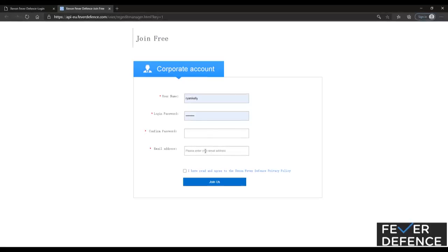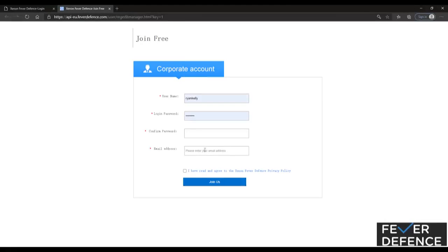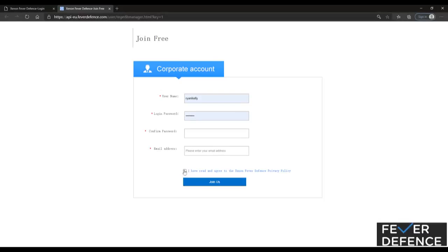That email address is the email address that will receive the email notifications if high temperature ever does present to your unit, but it can be changed in time if needed. Select the agreement button and select join us.